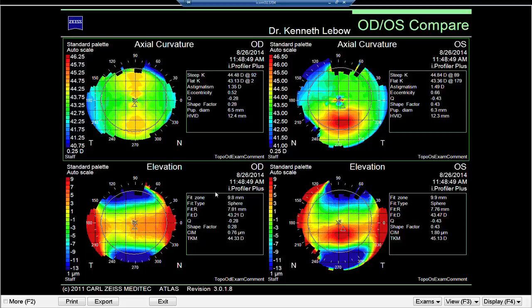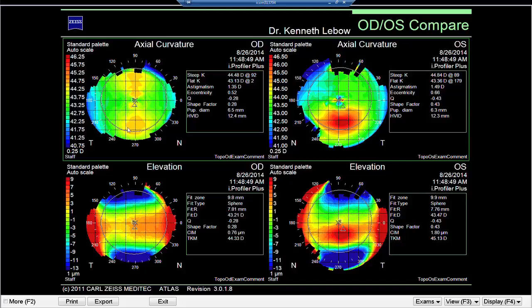This was a fascinating case because it really shows lots of interesting situations. The upper left image is the axial map of the right eye, and from form recognition you should see the presence of a fairly large with-the-rule cylinder — about a diopter and a quarter of astigmatism. This is a fairly normal presentation.